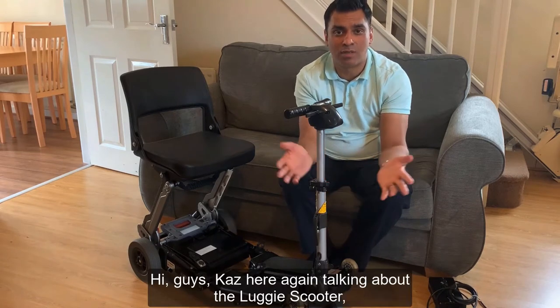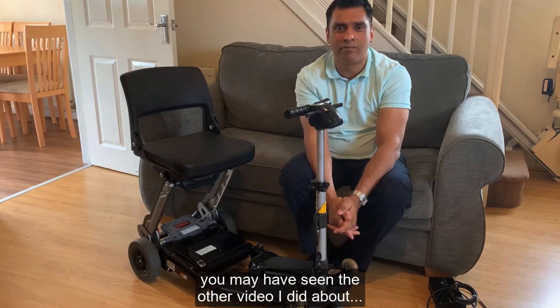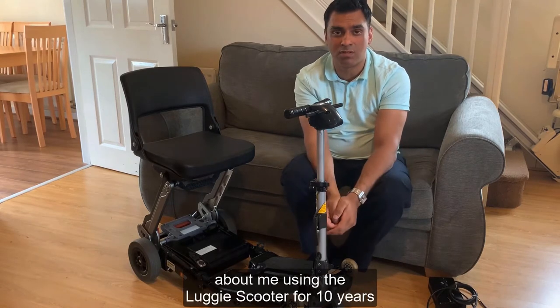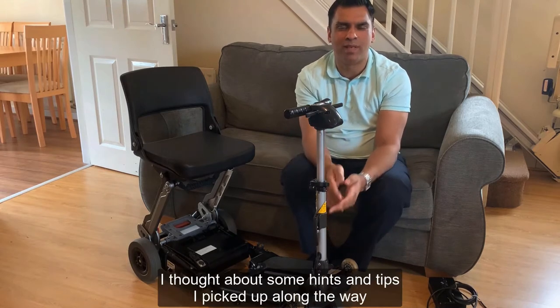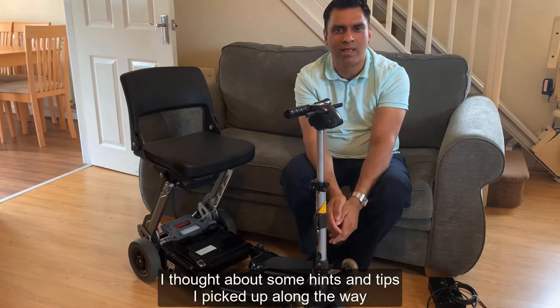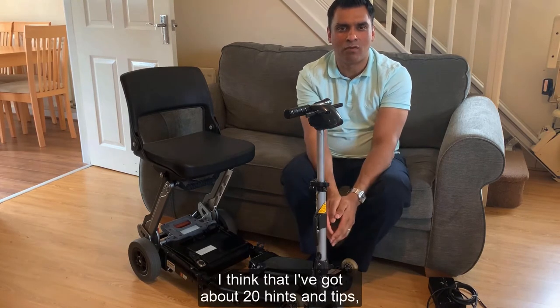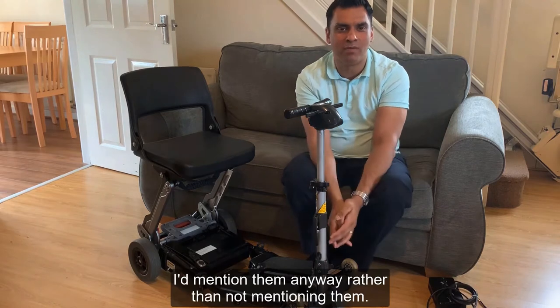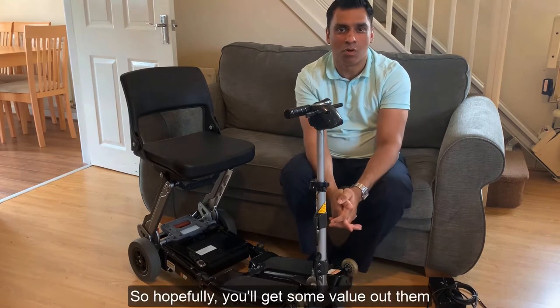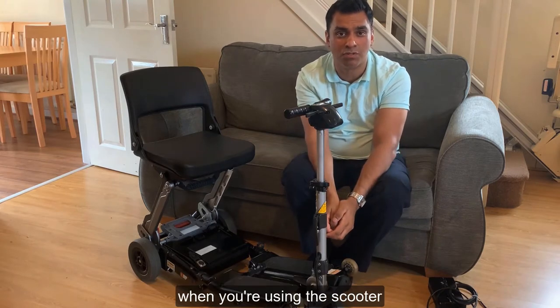Hi guys, Kaz here again talking about the Luggy Scooter. You may have seen the other video I did about 10 years of me using the Luggy Scooter and what I experienced. While I was doing that, I thought about some hints and tips I'd picked up along the way that I didn't really get a chance to put in the other video. I've got about 20 hints and tips, so hopefully you'll get some value out of them and find them useful.